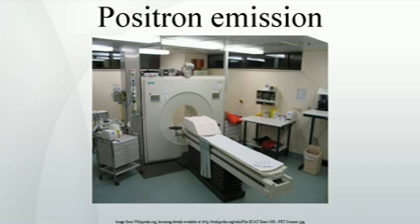Limitations. The minimization of radiation dose to the subject is an attractive feature of the use of short-lived radionuclides. Besides its established role as a diagnostic technique, PET has an expanding role as a method to assess the response to therapy, in particular, cancer therapy, where the risk to the patient from lack of knowledge about disease progress is much greater than the risk from the test radiation.